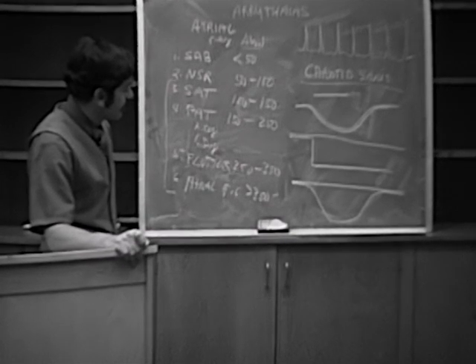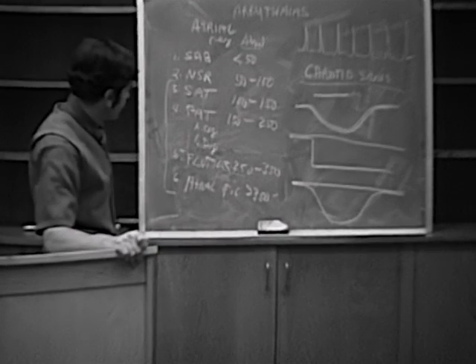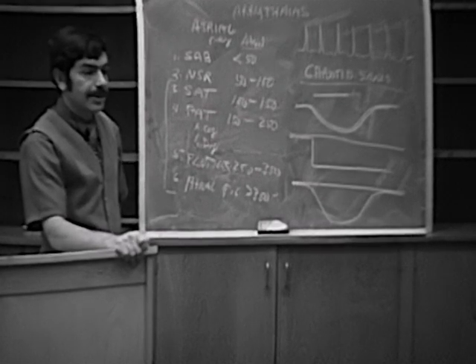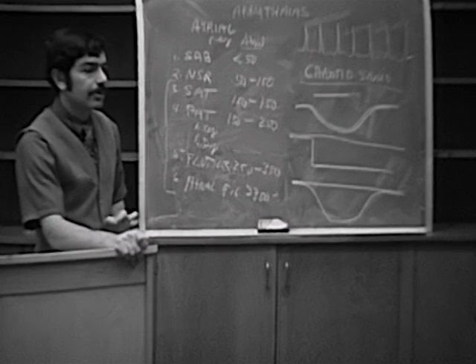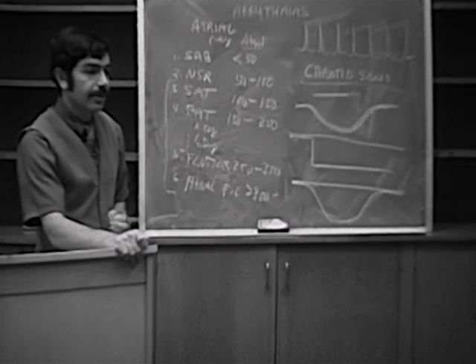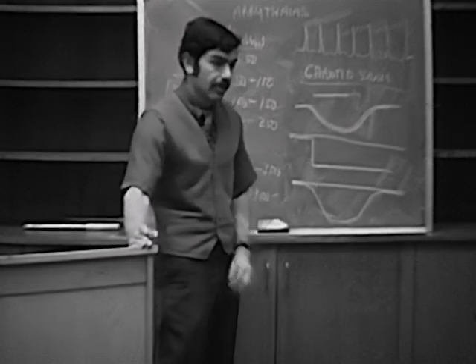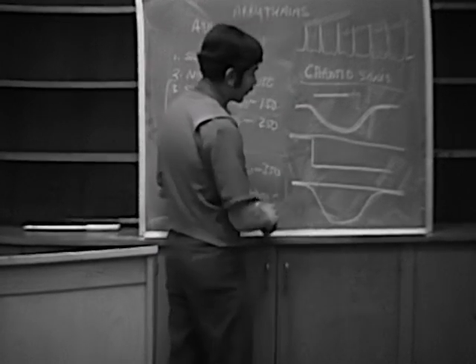Does that apply even in cases of PAT with digitalis toxicity when there isn't a block initially? Yes. PAT with latent block, you mean? That's what they call PAT with latent block. And the block is then brought out by carotid sinus pressure. That's why they call it latent block. It's there, but you have to do something to bring it out. It's latent. And you get the same response. Okay. Whether the block is there originally or not.